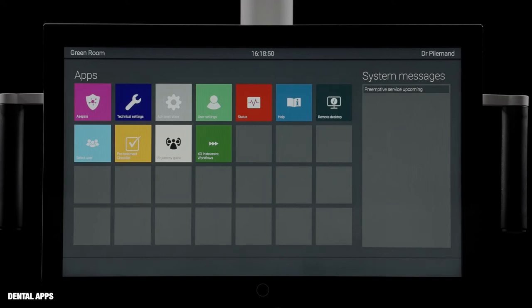Use the apps to set up and administer the unit, as well as to integrate the unit with other dental devices and software solutions in a network.